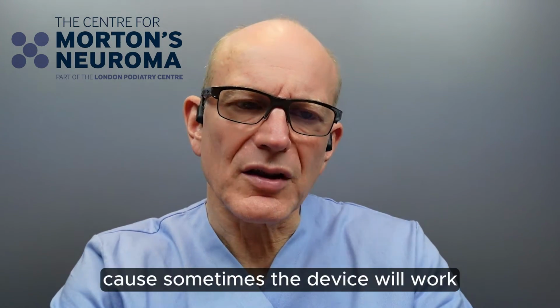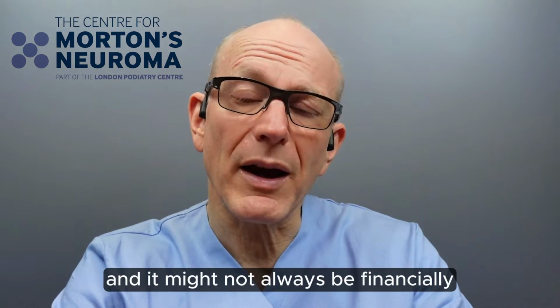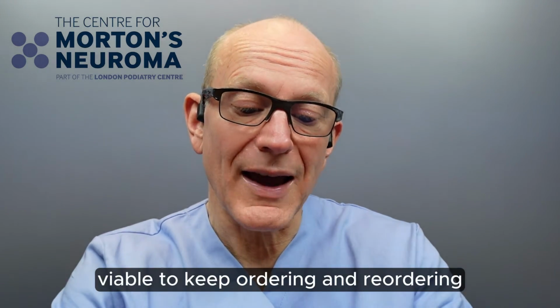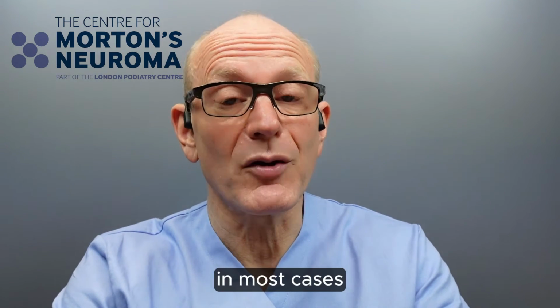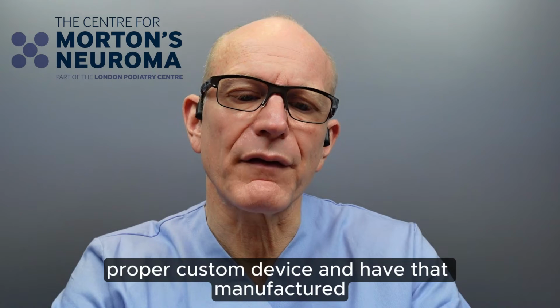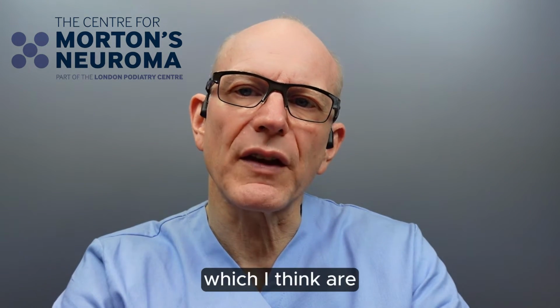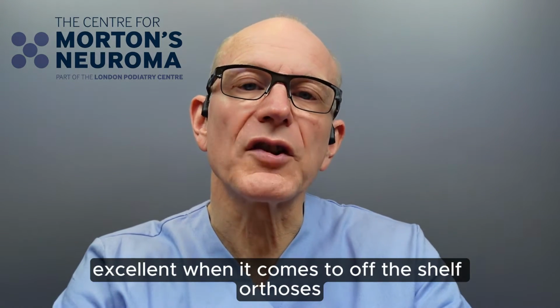And that's frustrating because sometimes the device will work, but then after a while it stops working and you're back to where you started, and it might not always be financially viable to keep ordering and reordering. And in actual fact, in most cases, it then becomes far more cost effective to order a proper custom device and have that manufactured. However, there are two devices I'd like to point out to you, which I think are excellent when it comes to off-the-shelf orthoses.